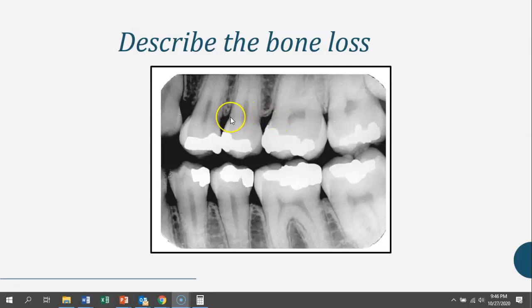There's the CEJ here. And this is an interesting space. The bone is way up high, and it almost looks like the periodontal ligament is widening there. But again, this could just be occlusal forces. It could be their normal. It could have nothing to do specifically with a periodontal disease process. But overall, I would call this person healthy and would say no bone loss.